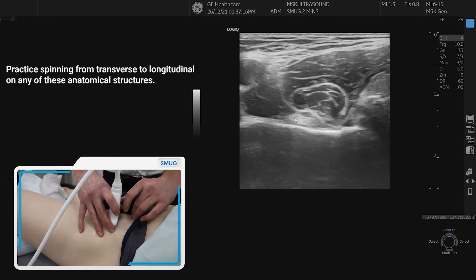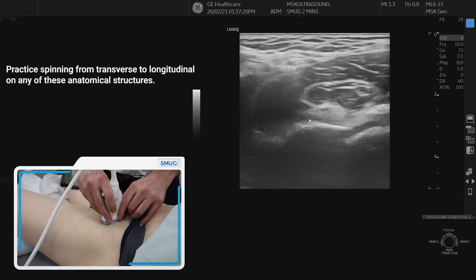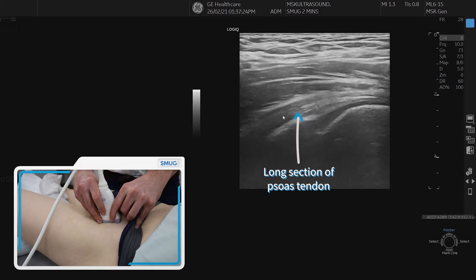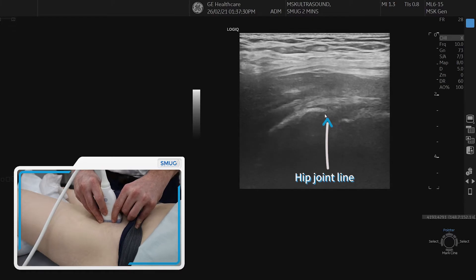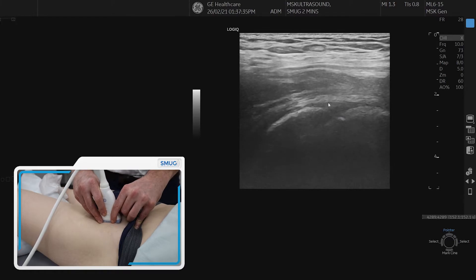Once we've orientated ourselves, we can spin on any of those structures. So if we spin on the psoas tendon, we can see the psoas tendon sitting on top of the hip joint. You can see the femoral artery and the pulsations above that, but we can also see the nice fibrillar alignment of the psoas tendon.